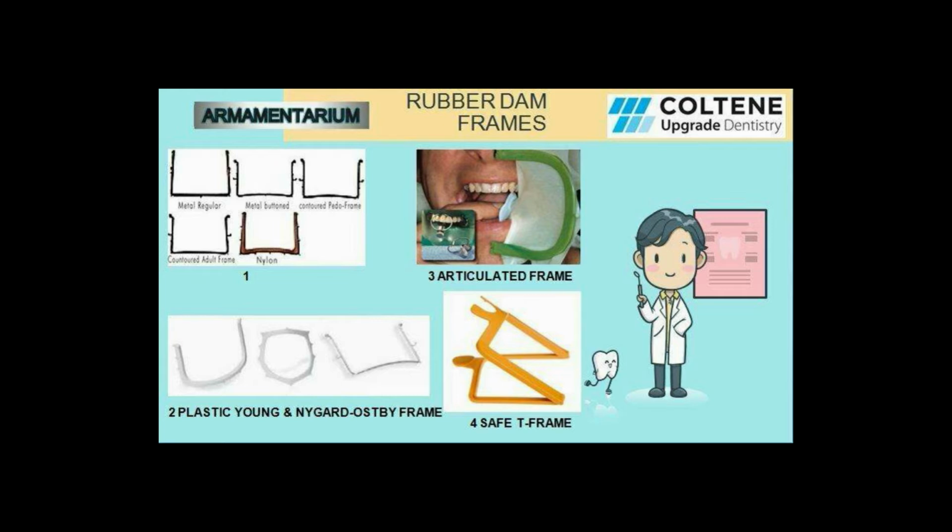The next one is the contoured pedo frame, in which the lower border is convex so that it takes the contour of the face. The same is available as a contoured adult frame too, and the next one is made up of nylon. The second picture, or the lower picture, shows the Young frames and the Nygaard Ostby frames in plastic material.